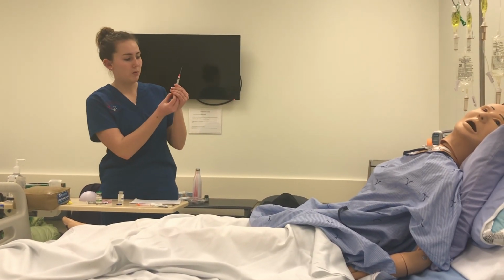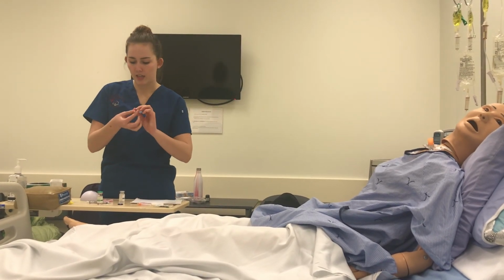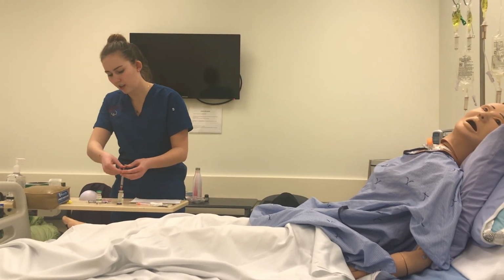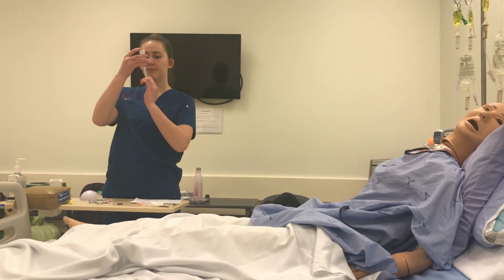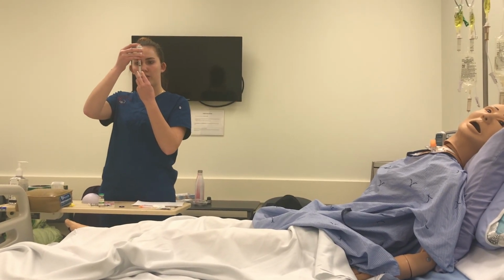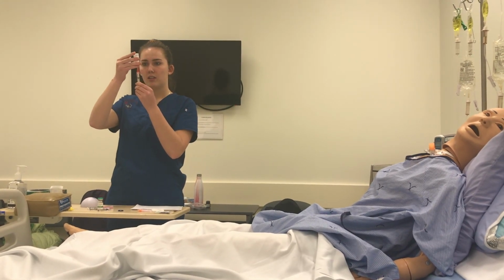I'm going to draw out 1 milliliter of air and insert it into the vial. I'm going to pressurize the capsule. Turn this upside down and draw out 1 milliliter of heparin. Okay. Take this out.